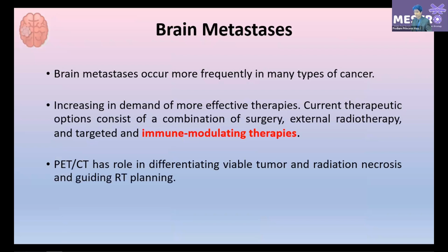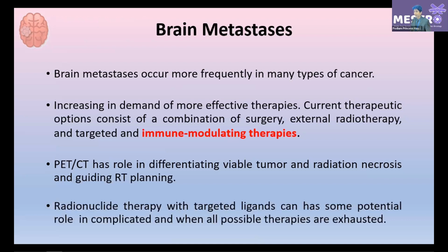I can skip the brain metastasis part, but you can localize the tumor with molecular imaging, either with gallium PSMA or with another tracer like gallium peptide. If they are positive, there is always a chance you can treat those patients with radionuclide therapy, either alone or in combination.